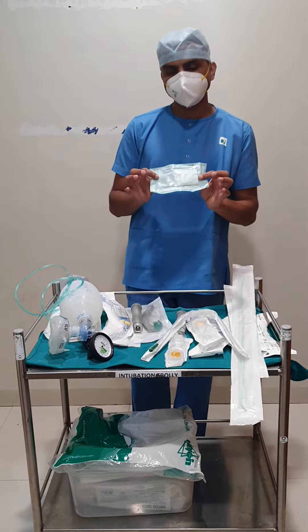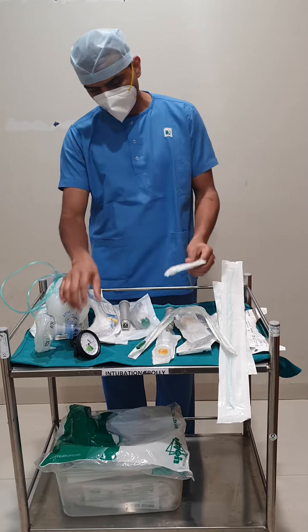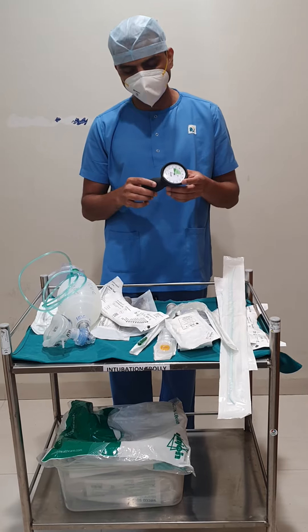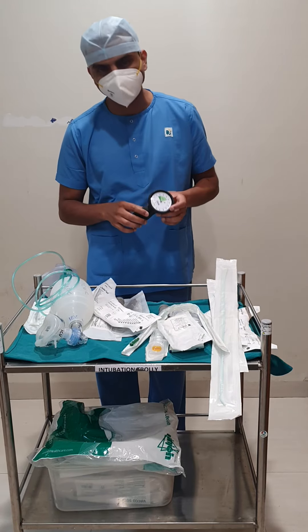This is roller gauze or ET tie, used to secure the ET tube. The last item is the cuff pressure manometer to check the adequate pressure applied through your cuff. Usually, it is 20 to 30 centimeters of water.